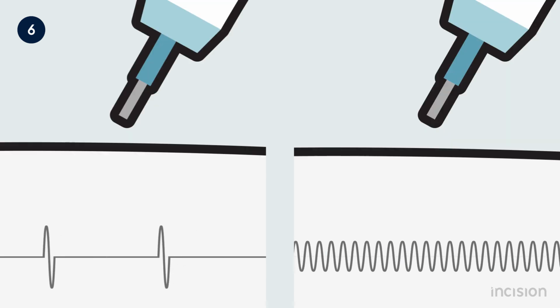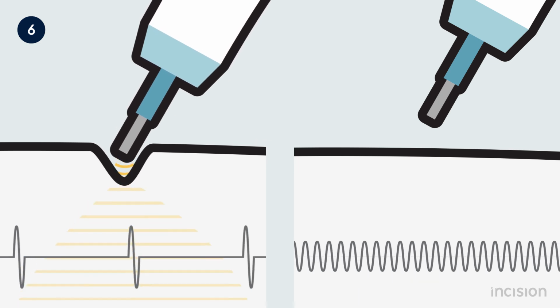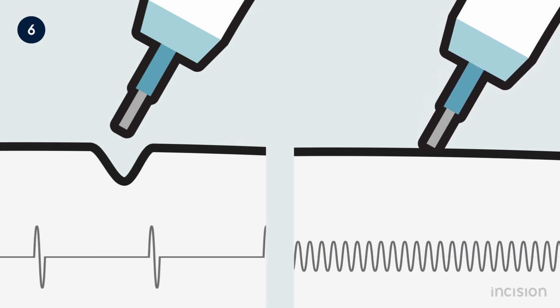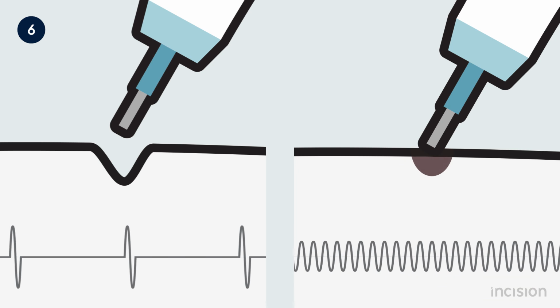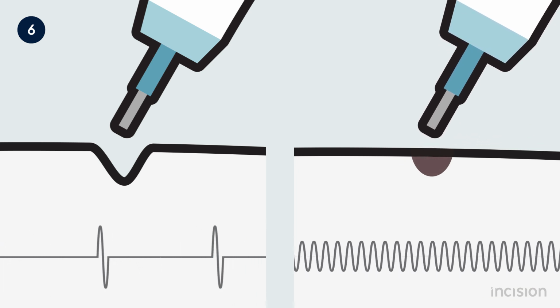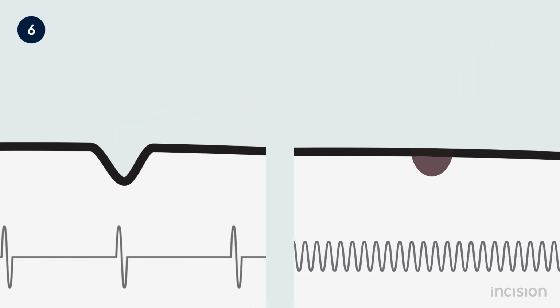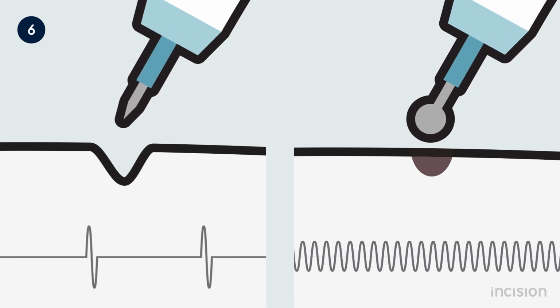Note that it is possible to cut using the coagulation waveform as long as the voltage is over 200 volt. It is also possible for power-controlled generators to coagulate using the cut waveform, having the advantage that a lower voltage is used to coagulate, making it more suitable for minimally invasive procedures. Yet, this might require adjustments to the size of the active electrode tip or to the maximum power settings.